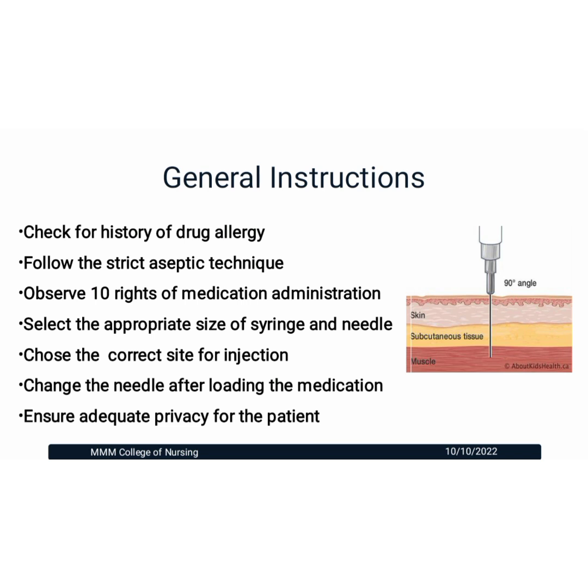The related general instructions are: check for history of any drug allergy, follow strict aseptic technique, observe 10 rights of medication administration, select the appropriate size of syringe and needle, choose the correct site for injection, change the needle after loading the medication, and ensure adequate privacy for the patient.